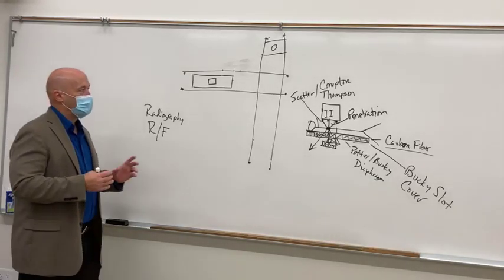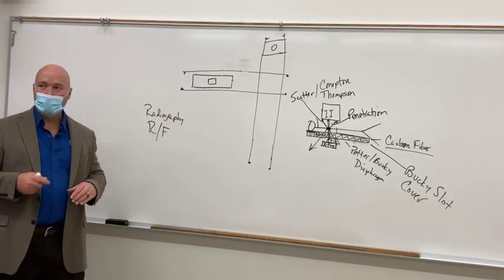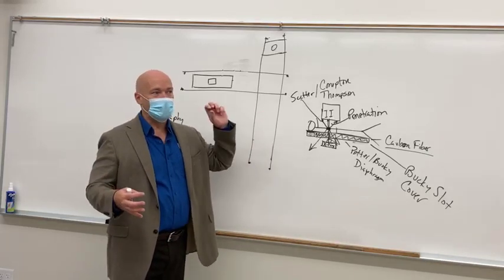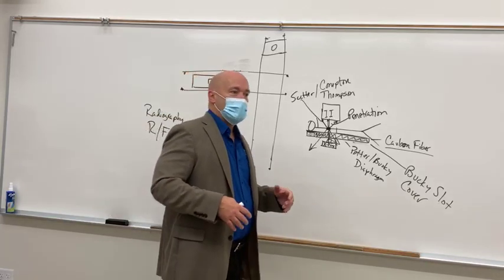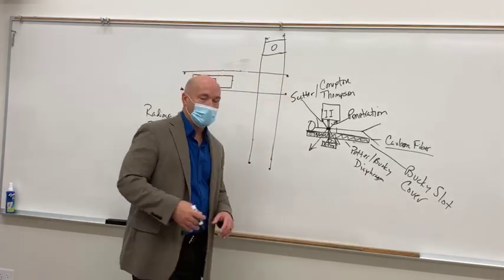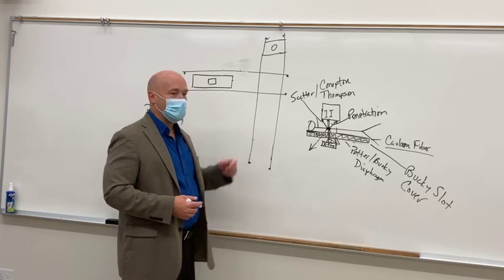The table, there are 2 different designs, depending on what type of table you have. If you're just working off of a radiography room, like what we have down in the lab, you step on a little pedal and it unlocks. We described the solenoids that unlock things in the last section. Remember talking about that? So you step on that, it activates the solenoids, and solenoids release the brakes so that you can move that pretty much anywhere you want it to go, as quickly as you want to move it, and very easily. And that's what we call a floating tabletop.